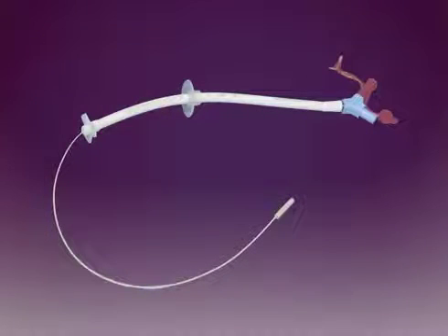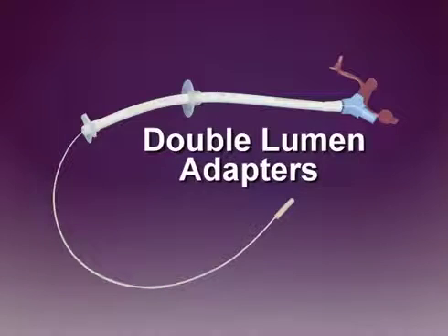Some jejunal feeding tubes have a double lumen adapter with two ports. This type of adapter allows gastric access without disconnecting the feeding administration set.